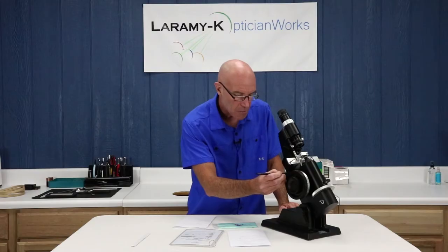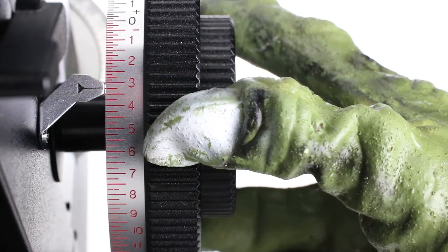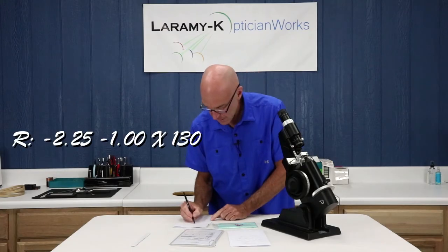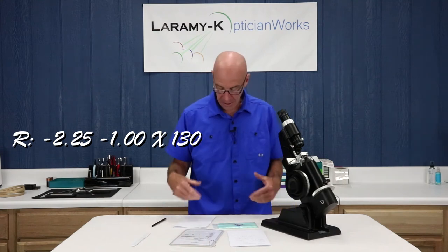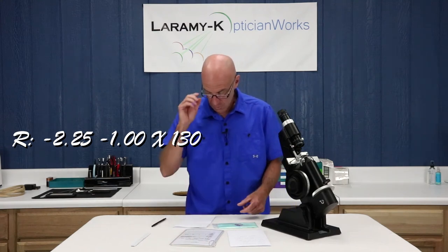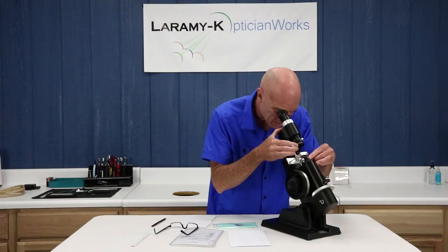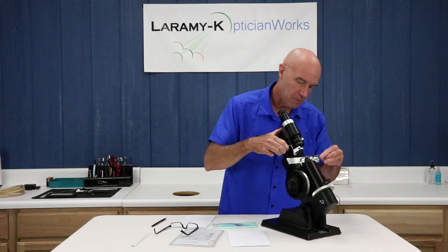Let me get my cylinder lines in focus. And now I'm at 325. So I went from 225 — that's one, two, three, four — so I've got a cylinder value of minus one. My right lens is a minus 225, minus one at 130. And I'm lined up well with my reticle so I can dot that one.